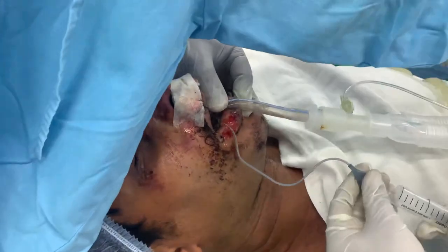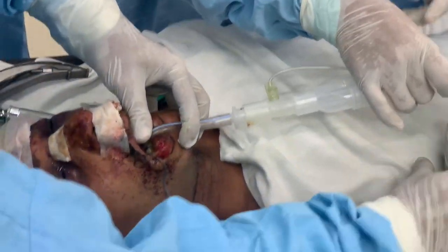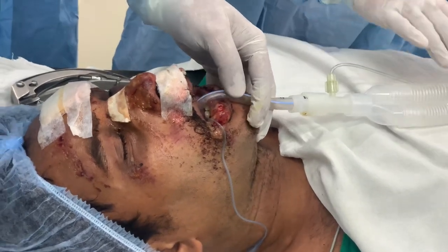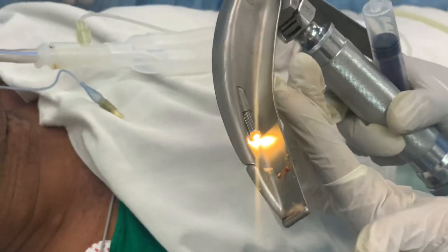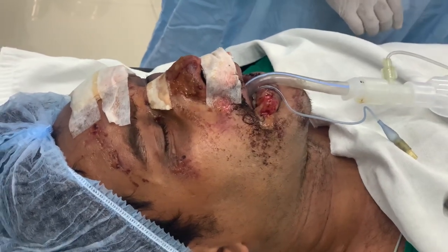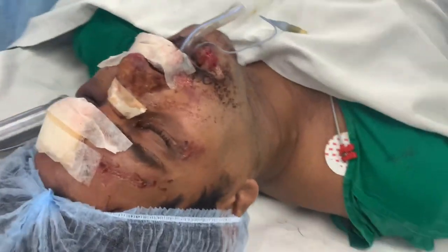So you will notice that we turned off the lights when the anesthesiologist is having a look inside the patient's throat before the tube is put in, so that he can see it clearly. There's a small light at the end of that instrument. See that? Yeah, I see that. There's a tiny light that comes on, so we don't want the big bright lights outside, to reduce the intensity for him inside to make it clear. And once the tube is in, then we get the other lights on.